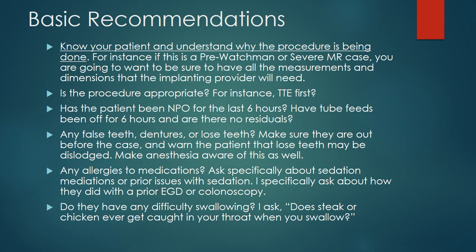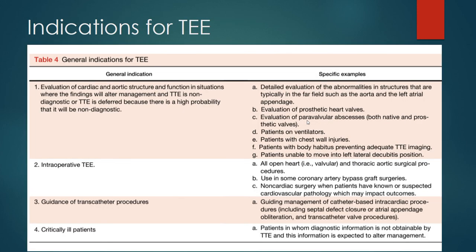I always ask about medications, or specifically about sedation problems with prior procedures such as EGD or colonoscopy. And when I ask about difficulty swallowing, I use the question, does steak or chicken ever get caught in your throat when you swallow? You'd be surprised how many patients have esophageal stricture, which is one of our contraindications for the procedure.